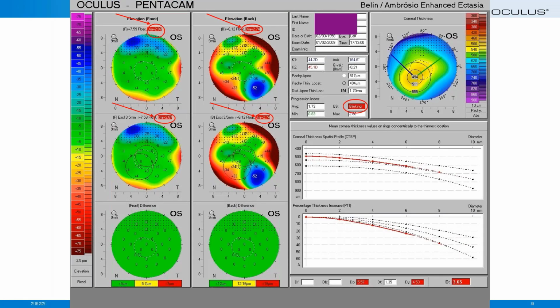We have another example now of a patient's upper lid that's significantly intruding. We're getting very small capture diameters here, 2.87 and 2.74. Again, these maps are unreliable. We can also see the QS value is red and is telling us the patient's blinking. Therefore, looking at this final D value as red and 3.65, it cannot be relied upon, and this map must be remeasured.